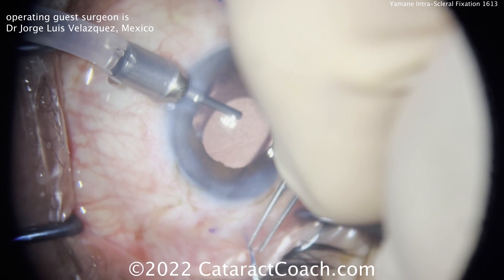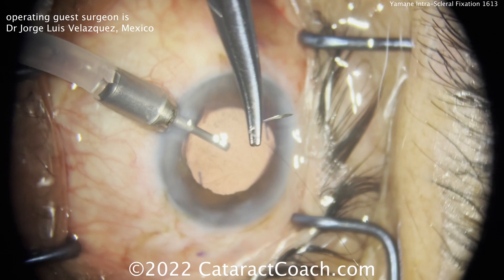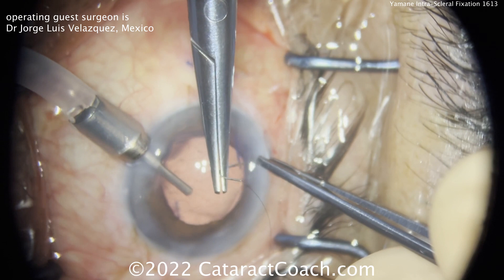Very nice technique. I want to commend the surgeon here for doing a great job, and also Brian Kim — brilliant idea. You may not do a lot of Yamane cases in your practice, but it's fun to know how to do them and learn from these.